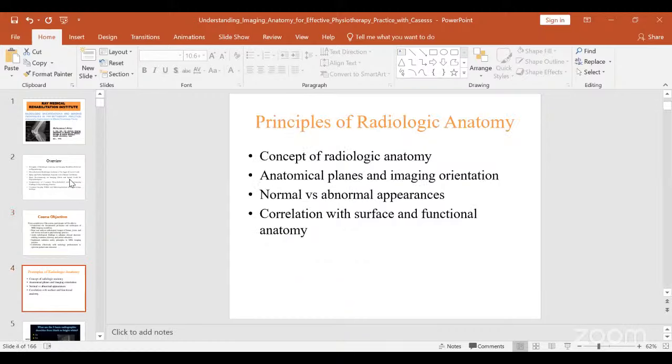Yes, sir. Thank you. Now, we are starting from the fundamentals, radiological anatomy. We know, of course, the patterns or structures that we see, example of the heart, of the lungs, of the bone, that we see on the images. This is a bone, this is a heart, this is a muscle, but it isn't exactly what it is physically. So it is a pattern, a replication, a projection of a structure or morphology of this bone or this heart that mimics the actual thing. So it does not look exactly like it.